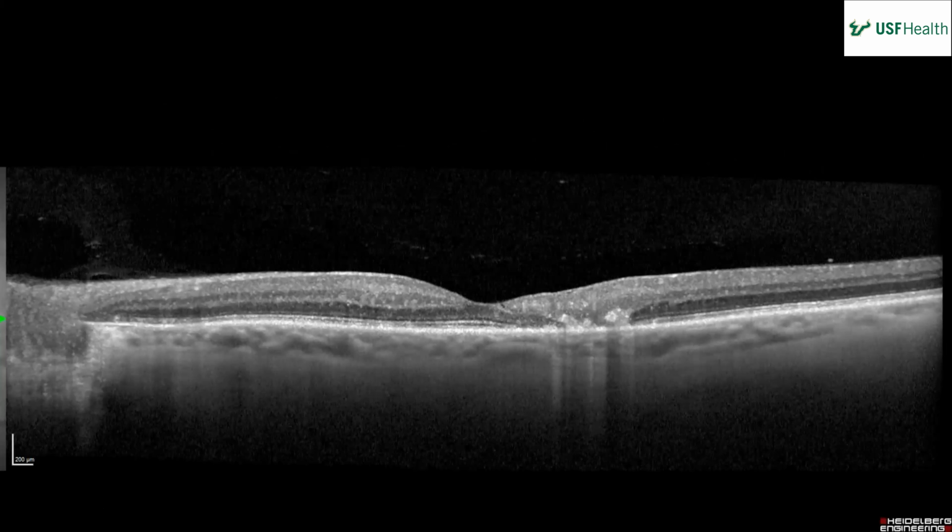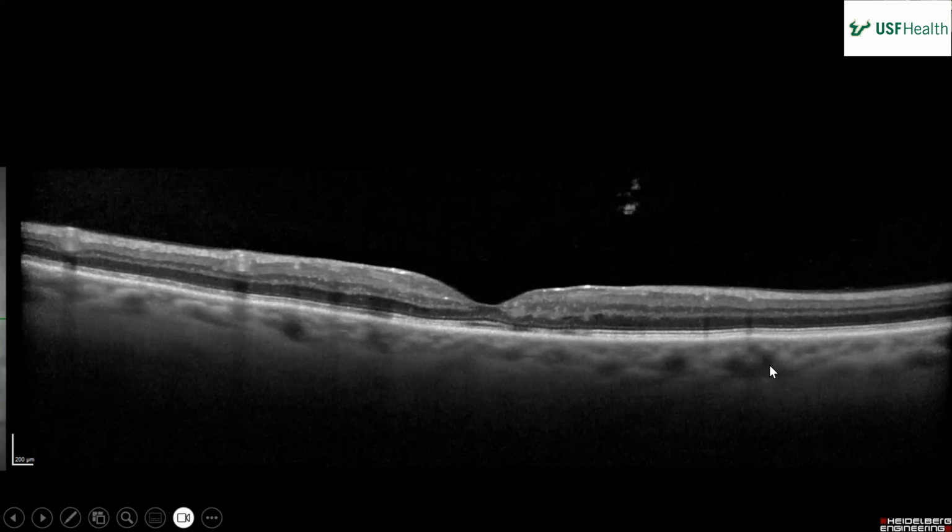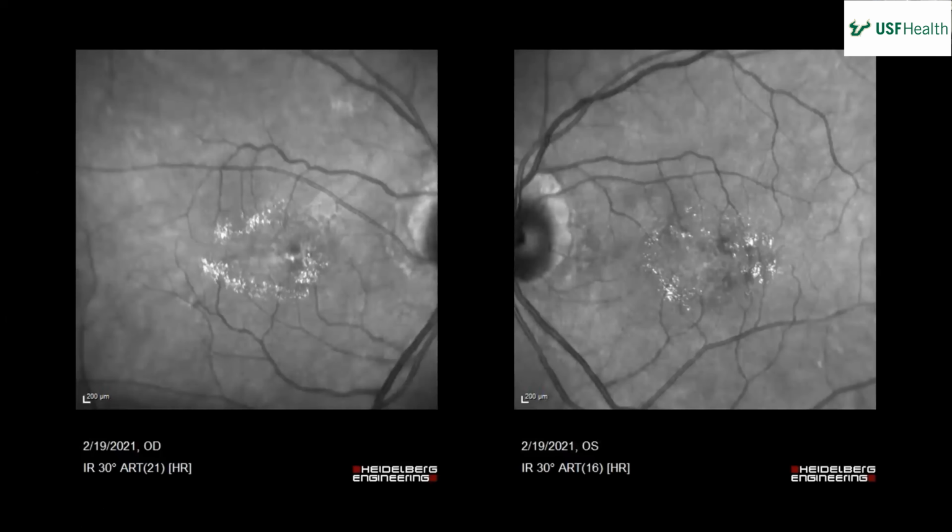So this is an OCT of the left eye. This one has some more pathology going on, just as there was in the color fundus photo. Here we have some deposits in the outer retina as well, casting some sort of shadow. Is there a word for that? Well, actually, that is kind of shadowing. So we talk about reverse shadowing. Yeah, it looks like reverse shadowing between, and then in there, it actually does look like a little shadow maybe. And that's the vertical cut. So, a similar picture, maybe more interretinal. Is that the last picture? Yeah, that's it. Go back to all the color. It's kind of interesting.